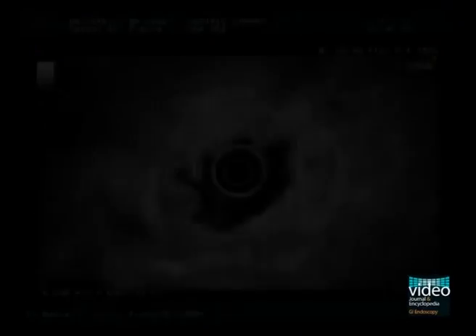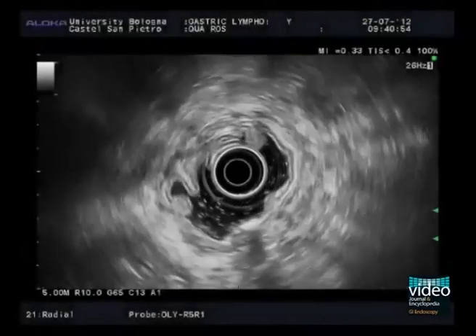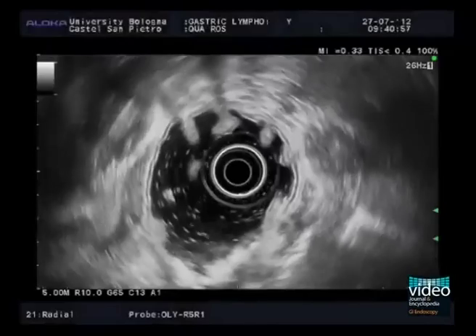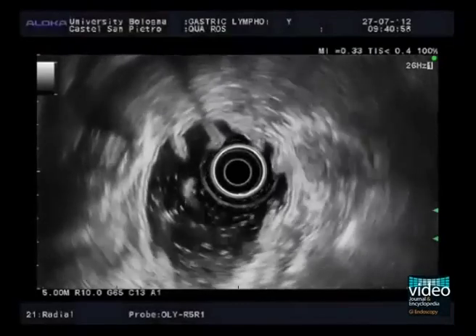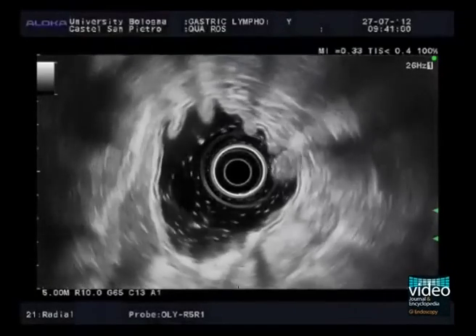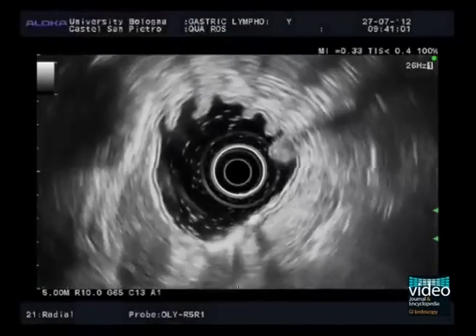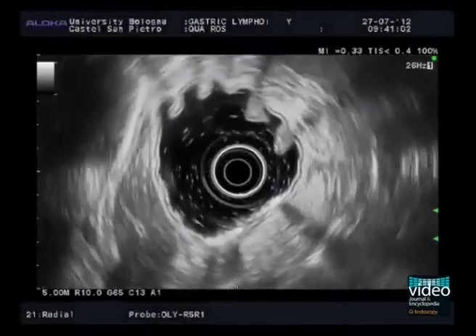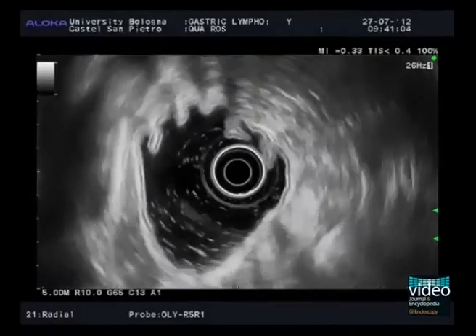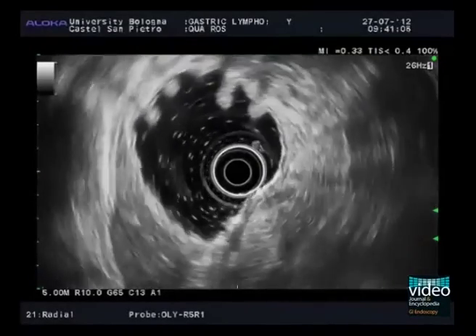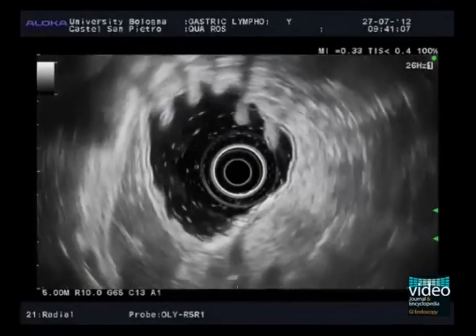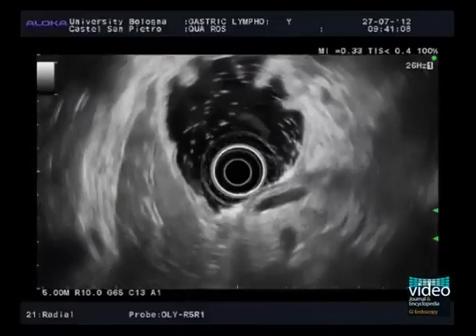As gastric lymphoma often presents patchy distribution, the exploration must be completed up to the cardia. For proper visualization of the layers, which are normal in this case, the transducer should be kept in the center of the lumen while withdrawing the echoendoscope.